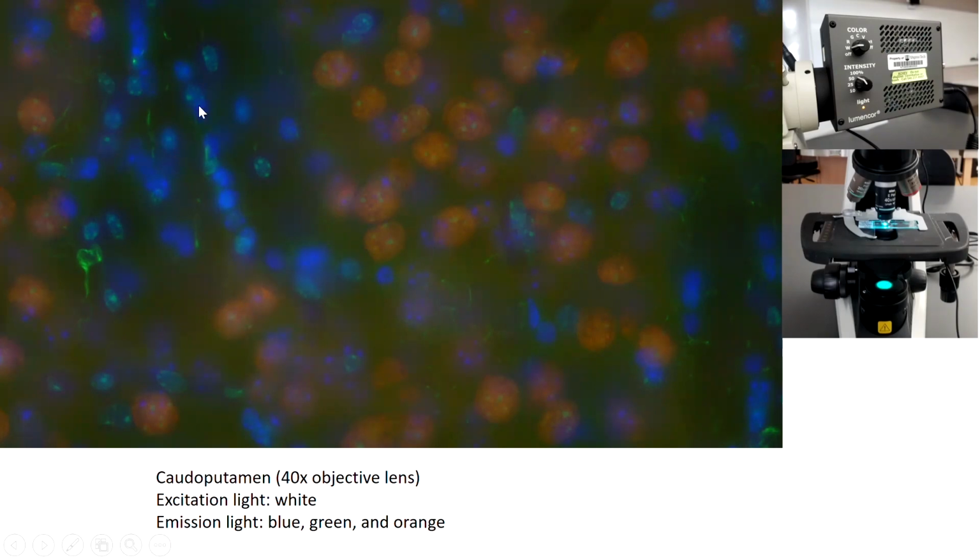And then around these oligodendrocytes, you can have some astrocytes. See all these astrocytes? Okay, there's this one here, and its nucleus didn't get stained much because the nucleus is probably in another focal plane. In this region, you have another line, three lines of nuclei here, and these are the lines for oligodendrocytes. And then in this region, that's majorly where the neuron soma stays. And same thing for this region.